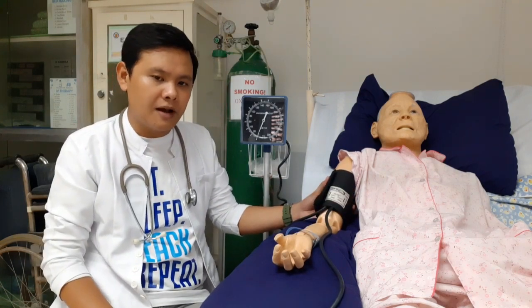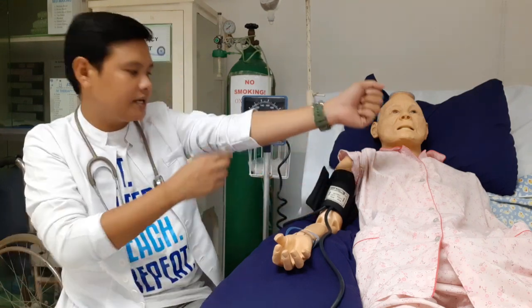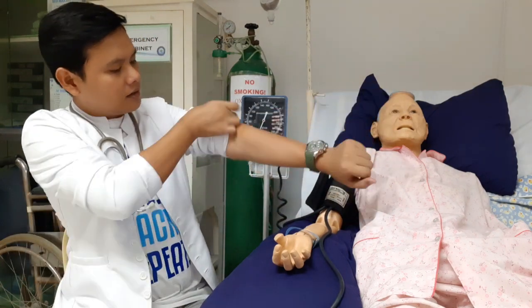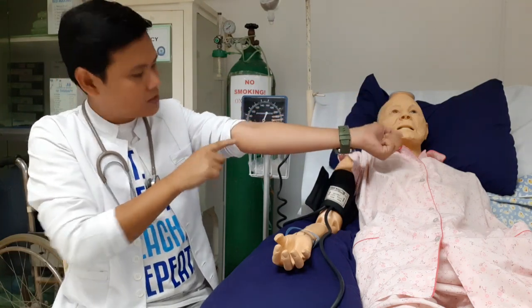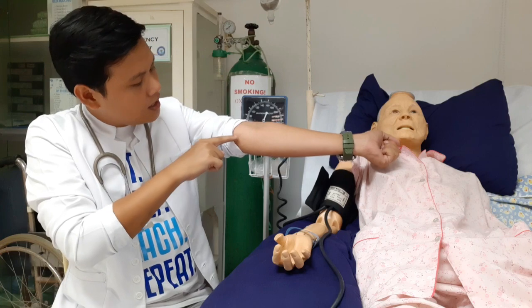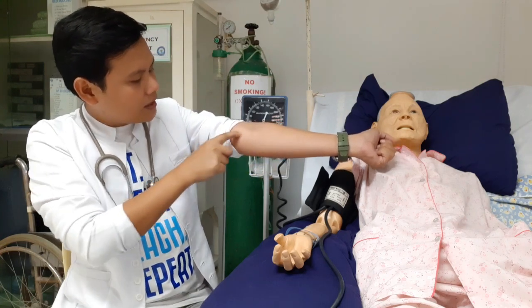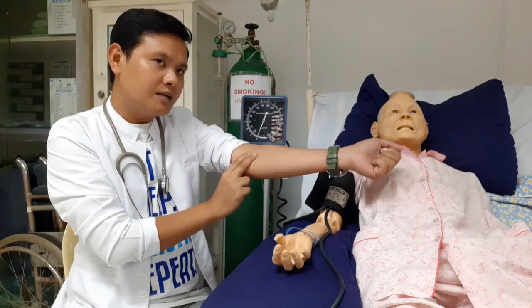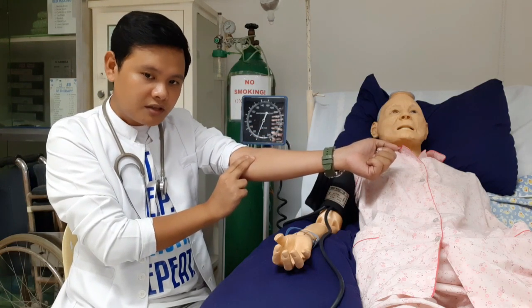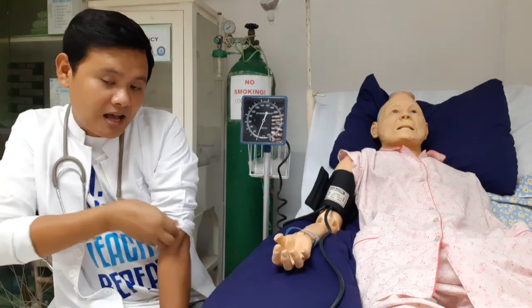And then you have to locate the brachial artery. So paano po ba natin nilolocate yung brachial artery? Usually guys, ang brachial artery is where? Andito yan. Kaya kung nakikita ninyo sa video natin yung color, kita yung brachial artery ko andito, sa may gilid. Madali lang i-locate yan. And also, maramdaman ninyo there's a pulsation. Pag naramdaman mo there's a pulsation, you already hit the brachial artery.